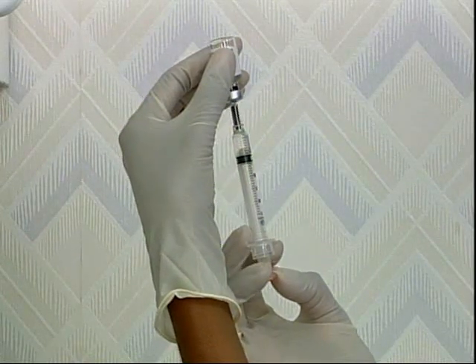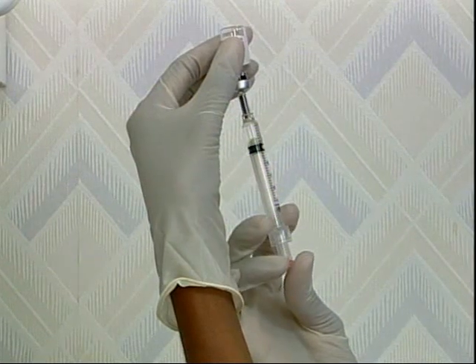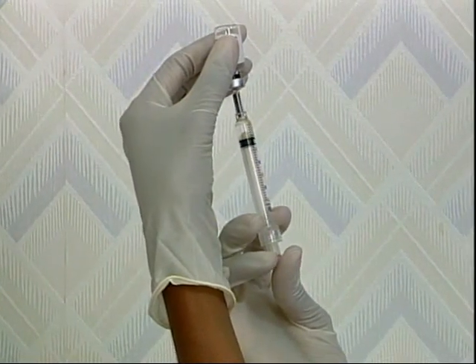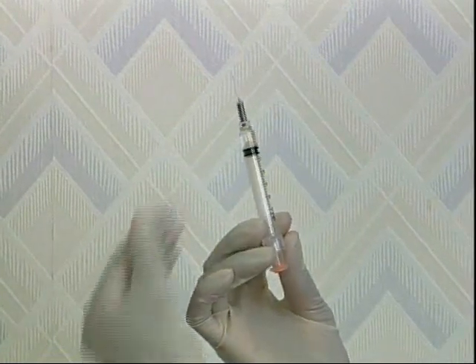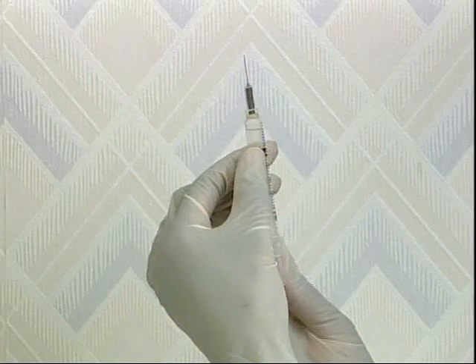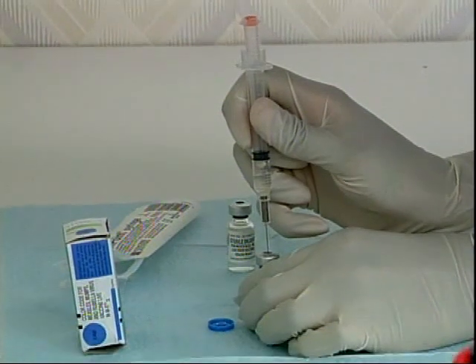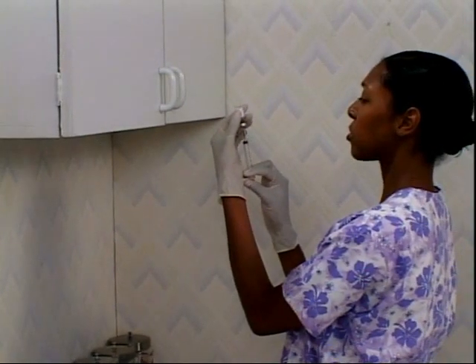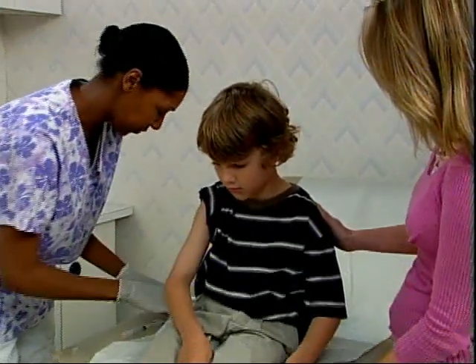Medications can be reconstituted and administered using the same VanishPoint syringe. Once the correct amount of diluent has been measured, remove the needle from the vial of the diluent and add a small amount of air. This air cushion will allow all of the diluent to be expelled from the syringe without activating the retraction mechanism. Mix the reconstituted medication according to the manufacturer's instructions. The reconstituted medication can then be drawn up and administered.